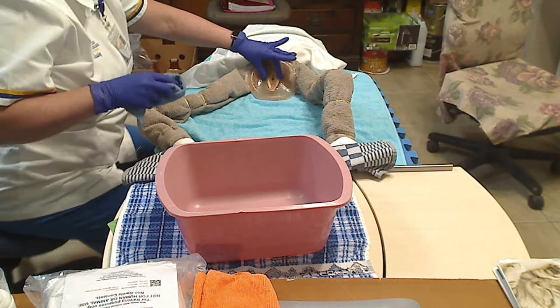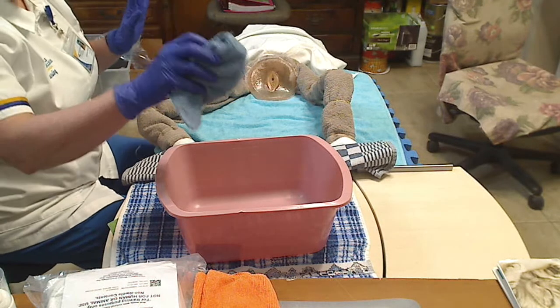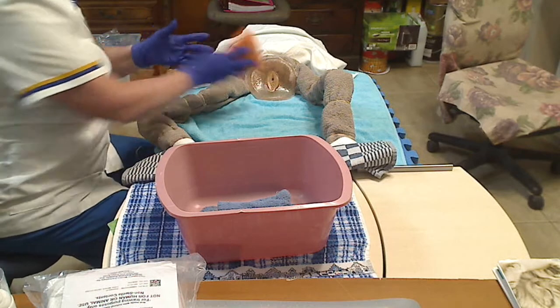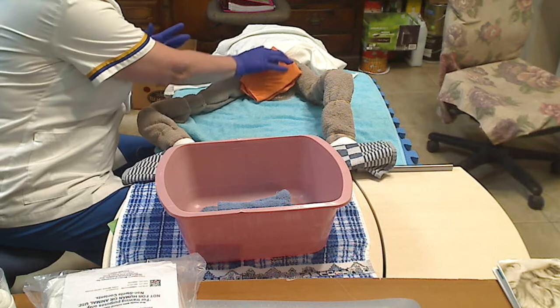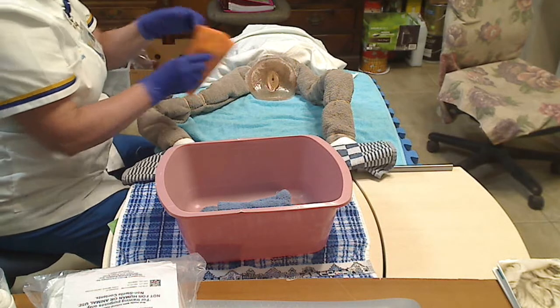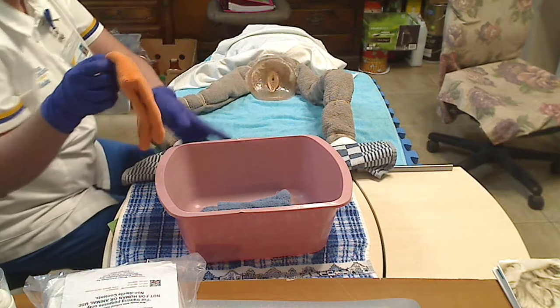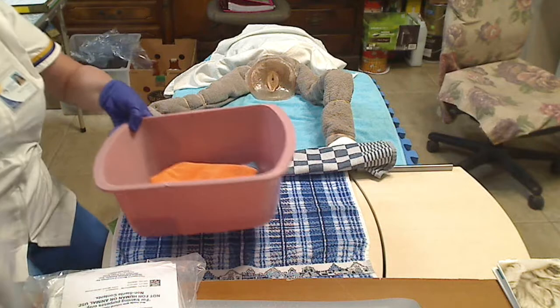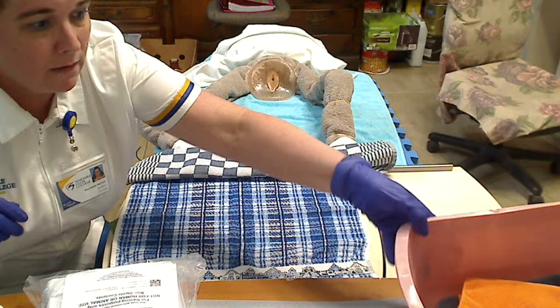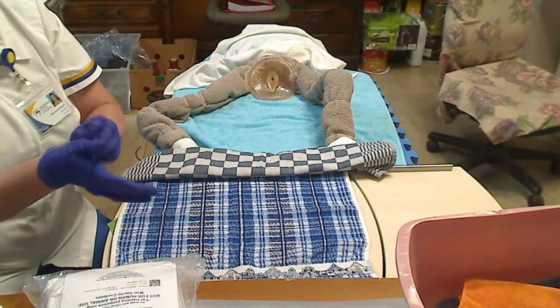So from here, I am going to go ahead and let go. I'm going to toss my dirty rag. I'm going to get my clean towel, and I'm going to gently pat her dry. And again, so as not to contaminate, I'm going to rotate the rag and pat her dry again so that now she is drying. I'm going to go ahead and remove all of those supplies. I am going to remove my gloves and hand sanitize.